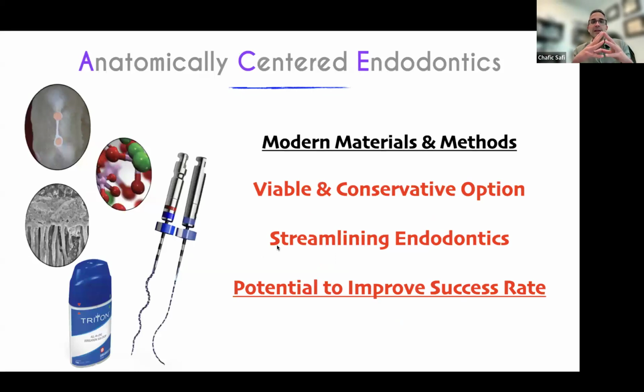And so this is what I call anatomically centered endodontics. This is the new state that we have to have in mind. This is the new concept that we have to favor in our clinic. Anatomically centered endodontics is today something that is possible thanks to the advancements of modern materials and methods with bioceramic sealer, XP3D Shaper Plus, XP3D Finisher, and Triton. And this streamlines endodontic treatment.